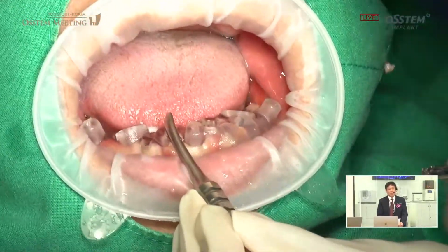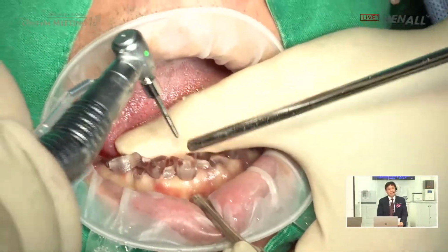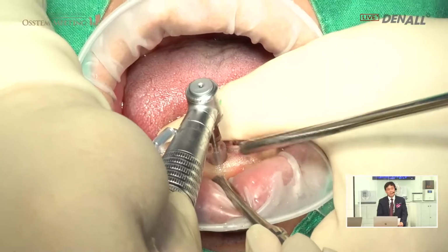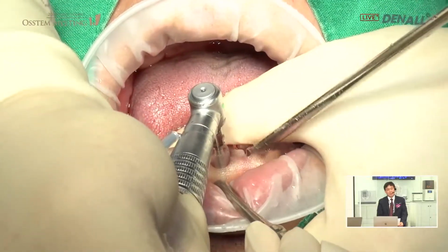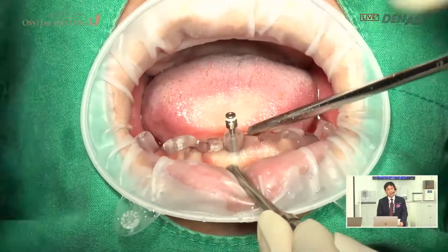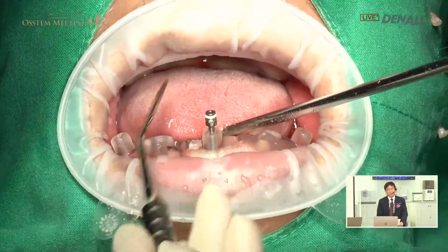Lateral anchor will be placed and preparations are being done. Anchor screw is now going to be fixated, about 80% of the depth.